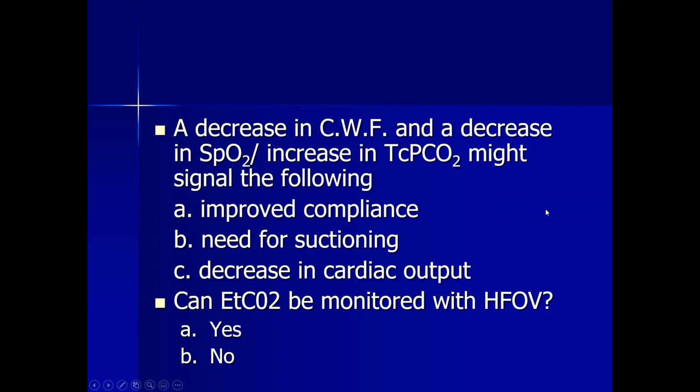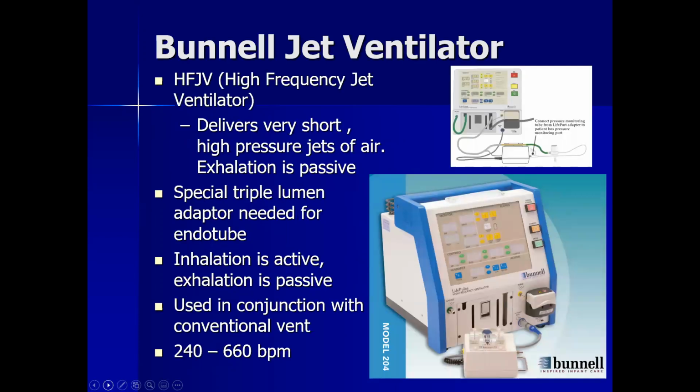Can end tidal CO2 be monitored with high frequency ventilation? No. So we should use transcutaneous. Okay, all right. So it's going to be a little later than 4 o'clock.